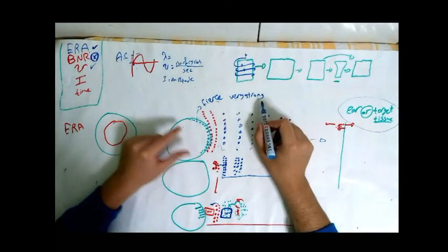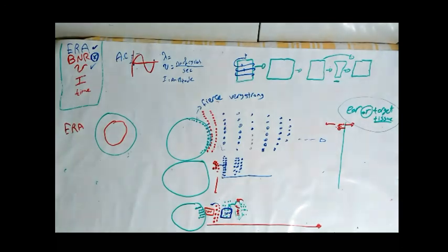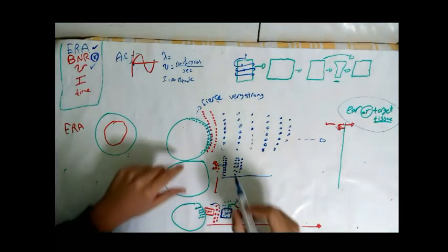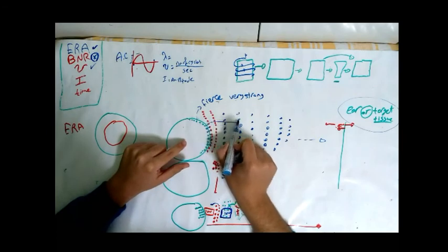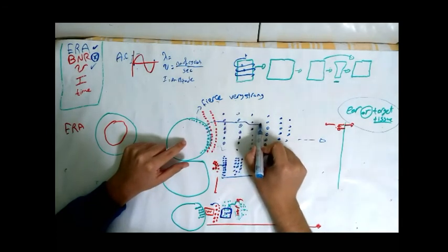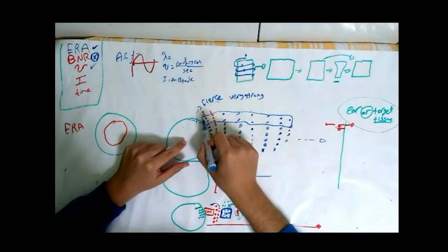Very strong means that the amplitude is increasing. So in some areas of the crystal, there is a very large velocity and very large intensity or amplitude of waves.